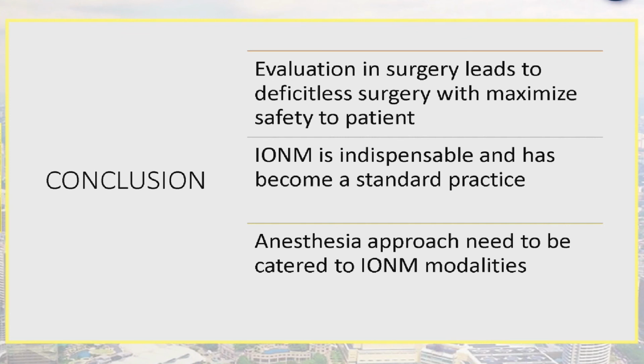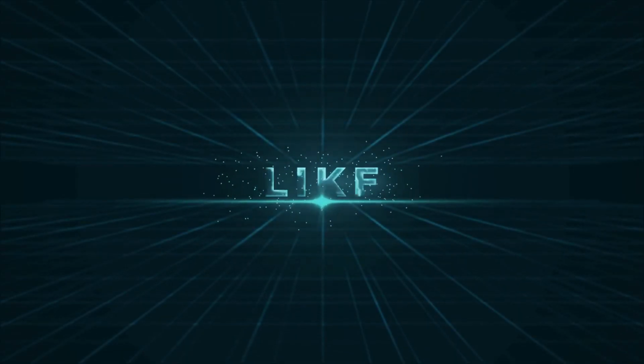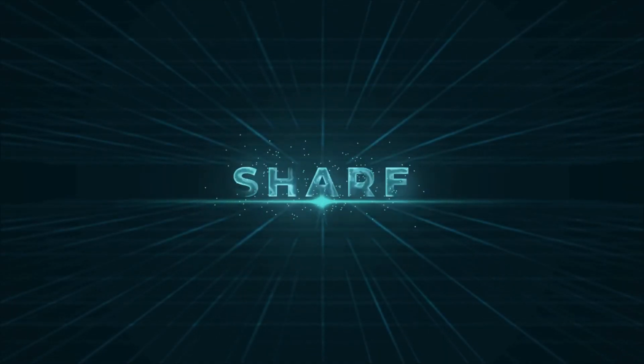IOM is now considered indispensable and has become standard practice in the majority of surgeries. And we have to take note that the anesthesia approach needs to be catered to the IOM modalities, because certain modalities have certain weaknesses towards the anesthesia that we use. With that, I conclude my lecture and thank you very much.